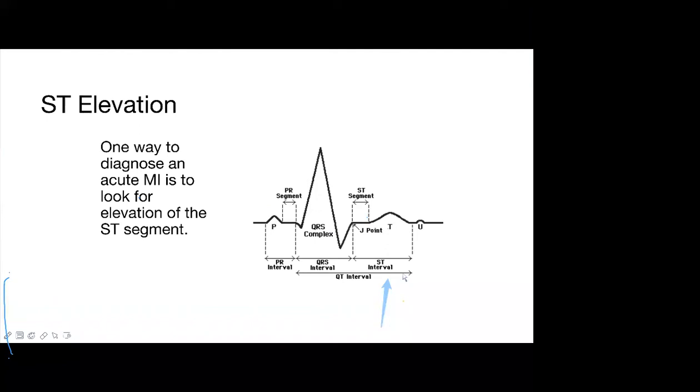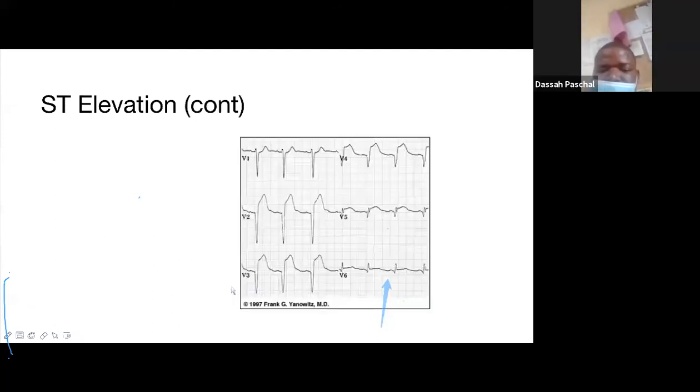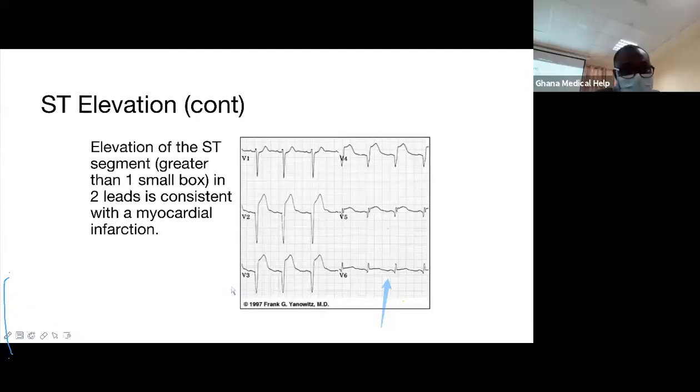Okay, otherwise, so the ST segment. Now. So typically, elevation of the ST segment is where we have.